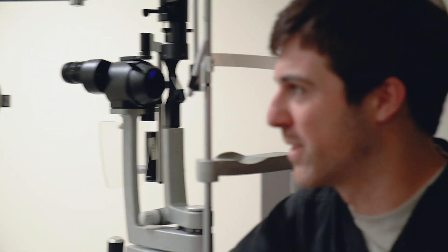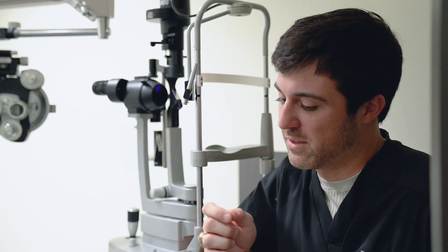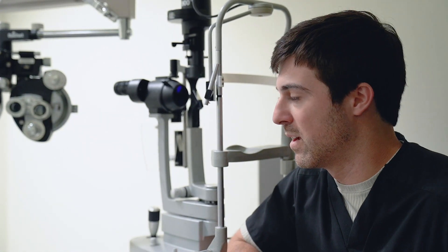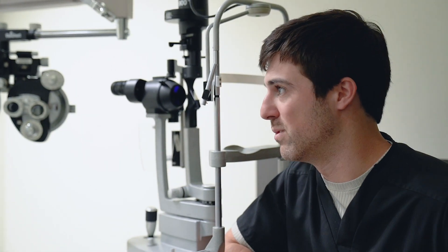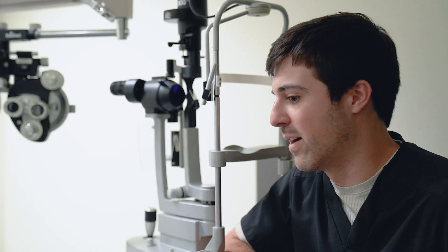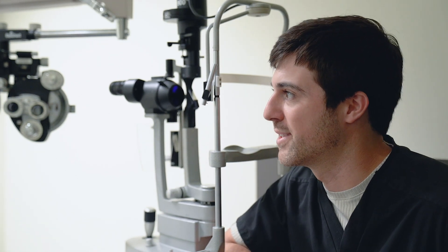So when Dr. Mayo takes the flap back, how does that work? The actual flap itself is created by the laser, so there's no blades involved with our technology now. Basically the laser starts the flap and then Dr. Mayo uses a blunt object — it's not a sharp tool — to trace around the area created by the laser so that he can lift it back. He basically just applies a tiny bit of pressure, something that you do not feel, and then slides that area back. And then that area self-seals back into place after we're all done. So it's a pretty seamless, quick process.